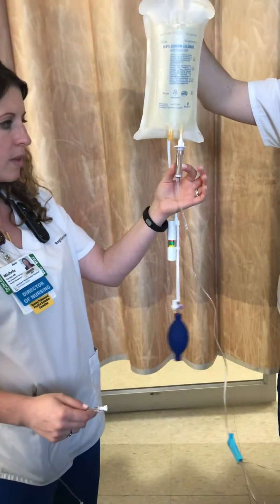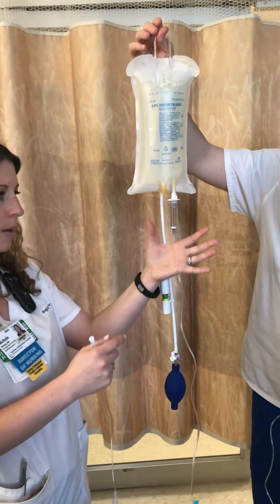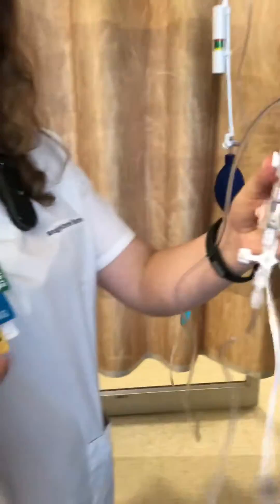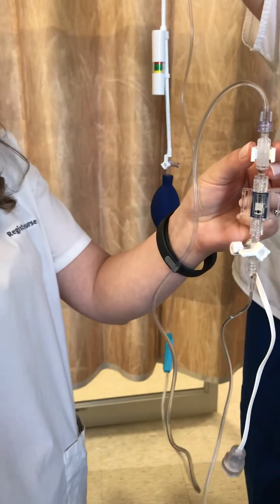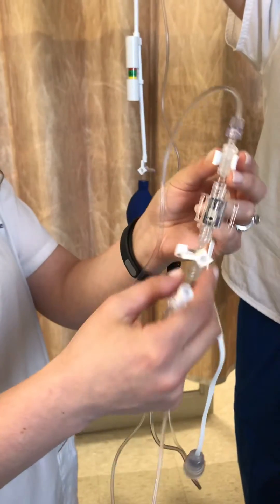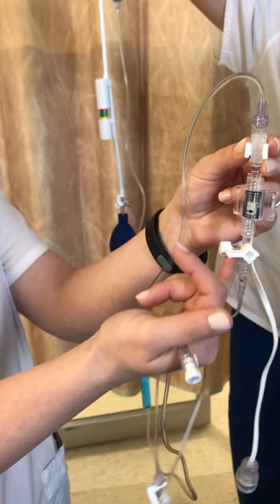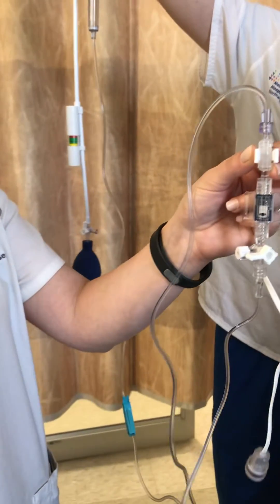Next, make sure your tubing has some volume by pressing the chamber — you usually want it halfway full. Then take your tubing and use the fast flush: when you squeeze it, it flushes the rest of the catheter, which is how you prime your line. When priming, make sure all your stopcocks are in the correct direction — off to the phlebostatic axis area where you'll be leveling for your patient — so you can flush the line properly.